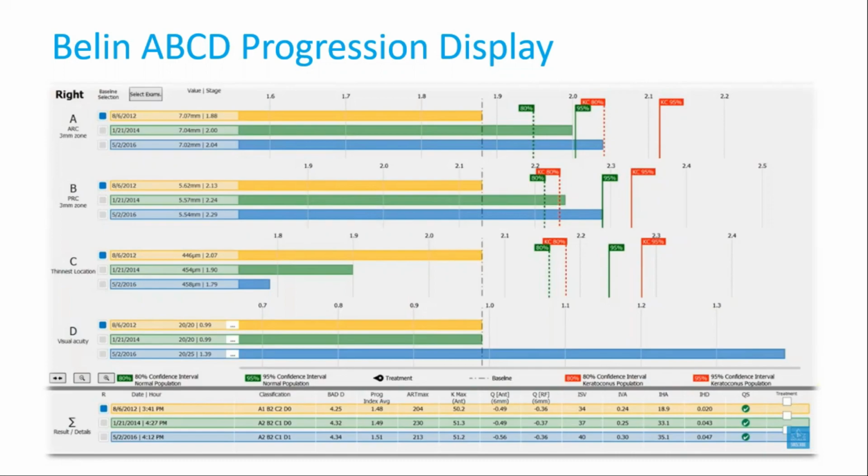Suppose you've been doing Pentacam over the last 10 years and you've done it 6 or 7 times. It'll show all those 6 or 7 maps from the last 10 years on one page, just like the GPA, the glaucoma progression analysis, which we see on Humphreys, which plots your fields, whether they are stable or getting better or worse. In the same way here, it'll tell you whether the ectasia is stable.